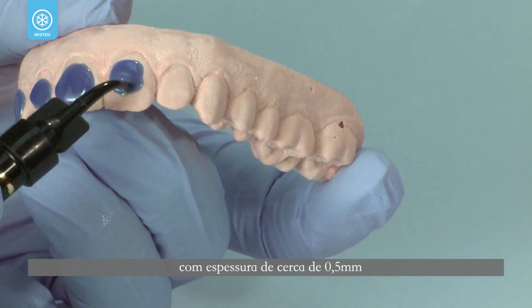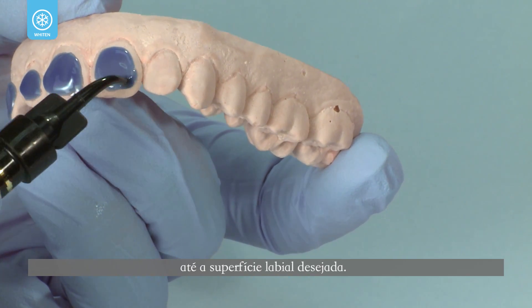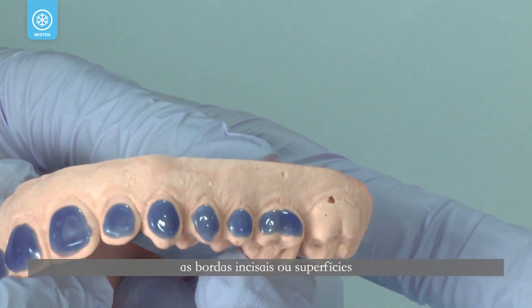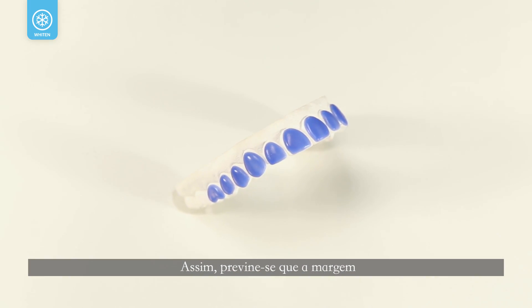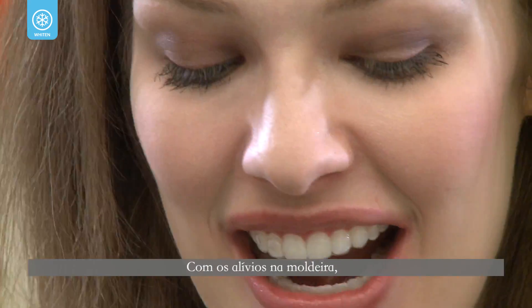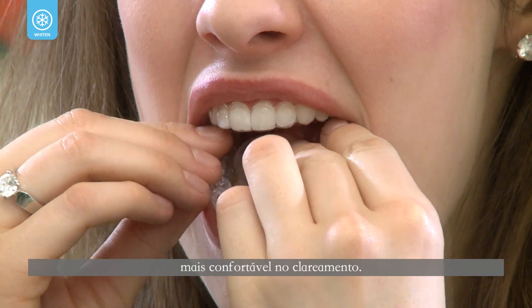To create reservoir space on the model, apply a layer of Ultradent LC block-out resin approximately half a millimeter thick onto the desired labial surfaces. Stay about one and a half millimeters from the gingival line. Do not extend onto the incisal edges or occlusal surfaces, as doing so prevents the margin of the tray from opening upon biting and can also impinge on soft tissues. With reservoir space in the tray, patients can have a more comfortable whitening experience.